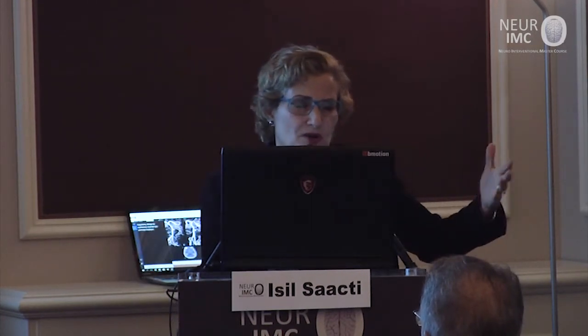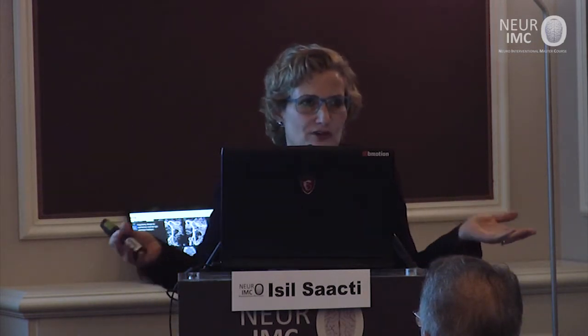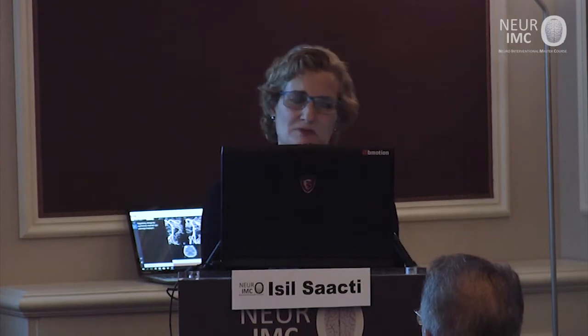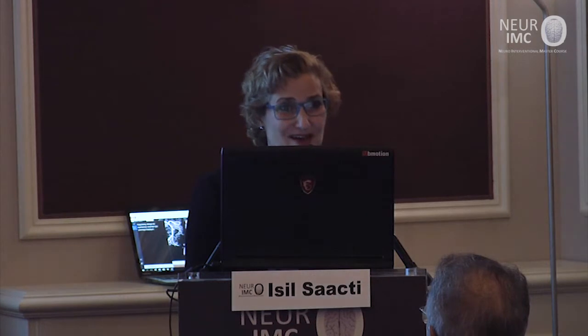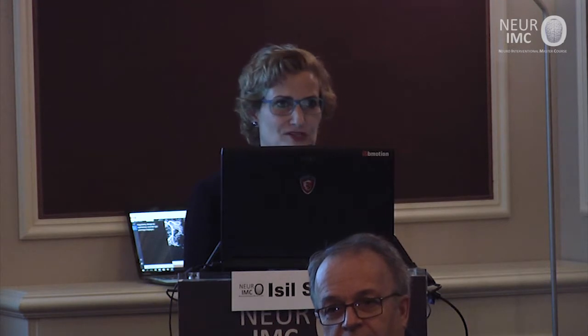After we give the drug, the patient was put on general anesthesia, and we did the angio. It is probably an hour before we place the device, because half an hour it takes for the anesthesia to prepare the patient and then the angio. Now, if you're using Plavix, do you wait more? Well, actually, we do not trust Plavix, to be honest. We do not believe its response, and also it takes much longer, 2 to 4 hours at least. So nowadays, we always go for prasugrel for that purpose.